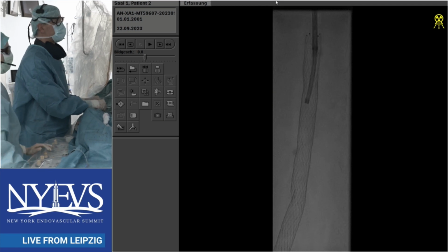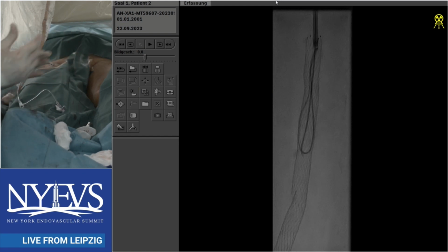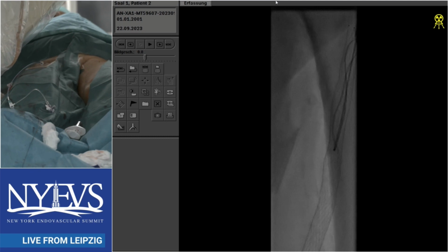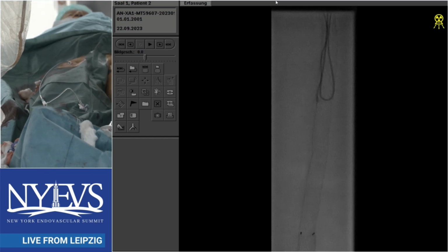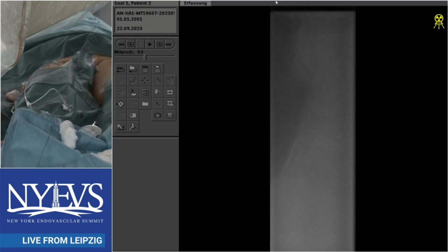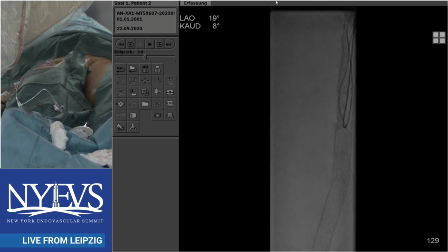But once we got Rotarex on the shelf, I was telling our colleagues here that the Rotarex has really changed our practice. We use the 8 French Rotarex in all ISRs, and have had very satisfactory results. We learned from Andre, after we first got the device, that we could use filters with it, which is very exciting for us because we worry about embolization, and the filters have helped prevent any embolization from occurring. So in our practice at Sinai, generally it's Rotarex as a first go-to, followed by either covered stenting or DCB, depending on what we see.